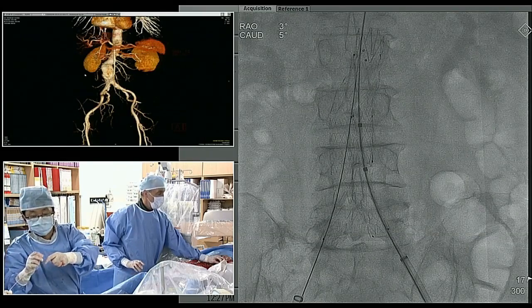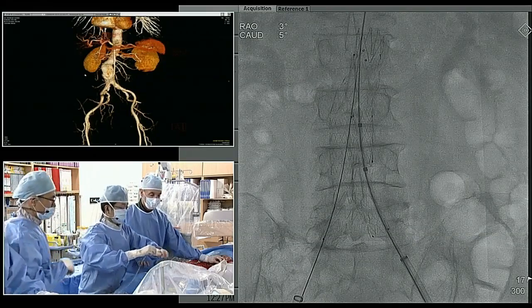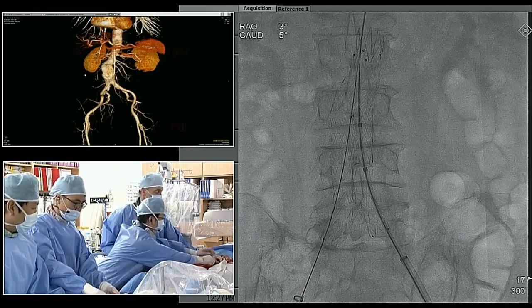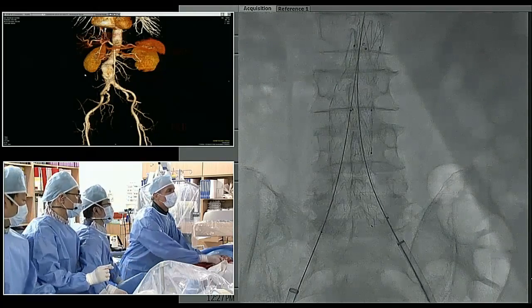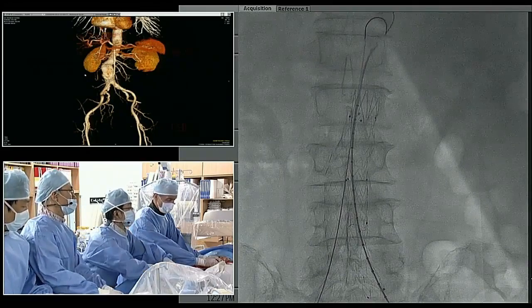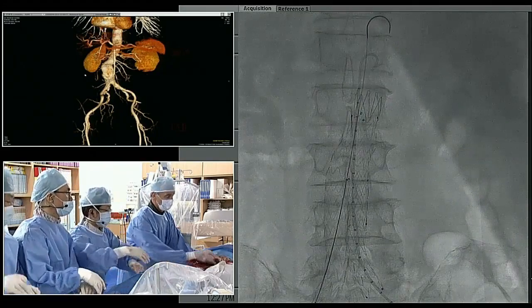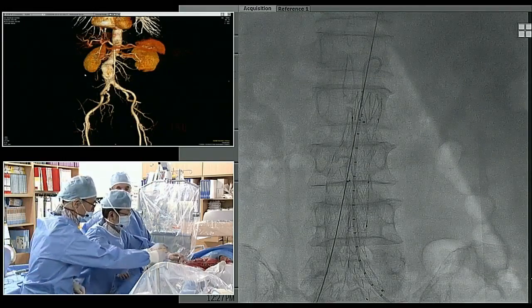So Bob, we're going to take a final image, as you said, and then we'll start our per close. Dr. Kang and Choi have already done that very well, so I'm sure it's going to be great. Yeah, so it's been pre-closed. Okay, wire out. Okay, big injection.